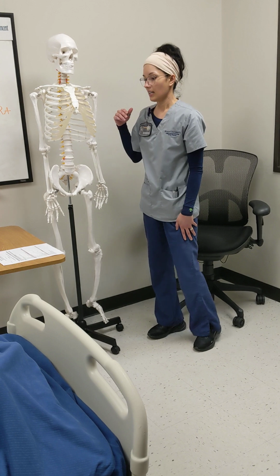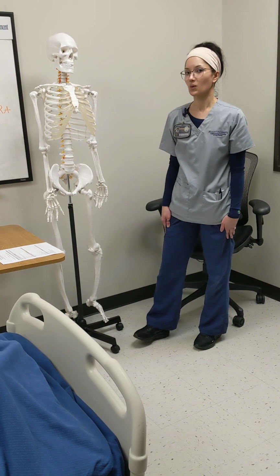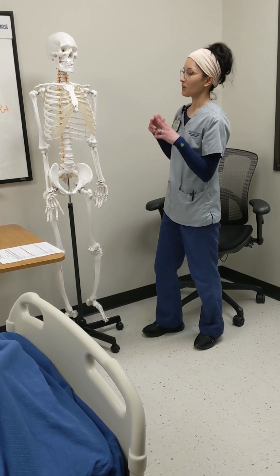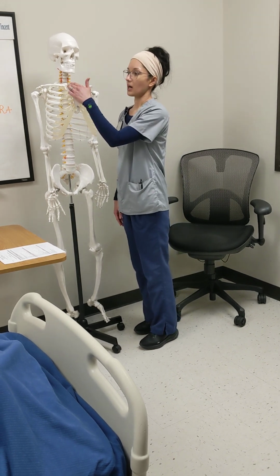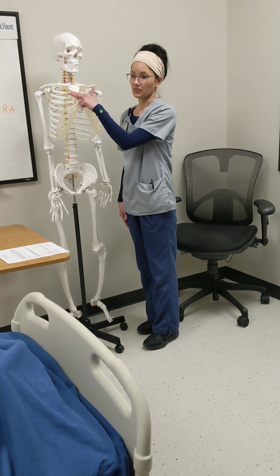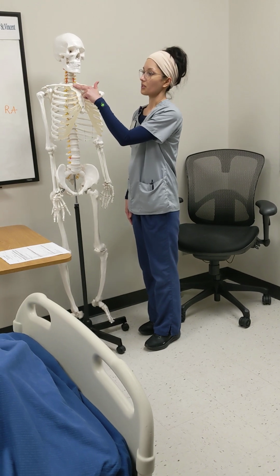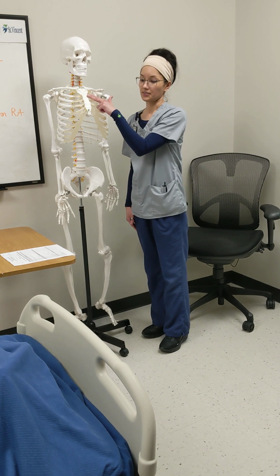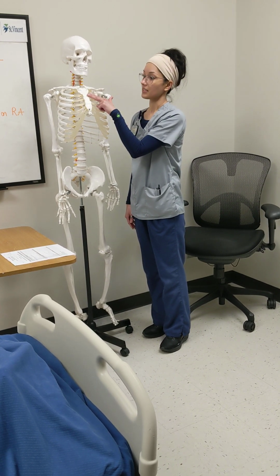All right, now Walter, I'm going to take a listen to your heart. With my pretend stethoscope, I will come to the right sternal border, second intercostal space, and auscultate the aortic heart sounds. Then I will come over to the left sternal border, left second intercostal space, to hear pulmonic valve sounds.